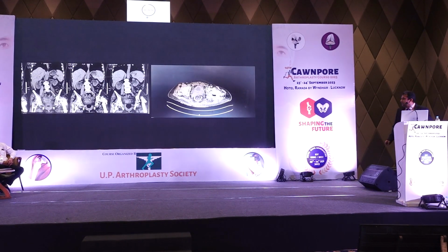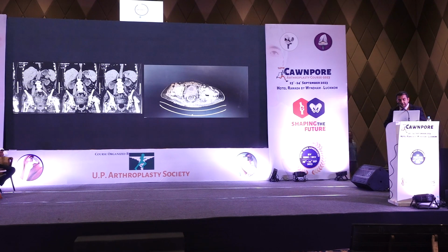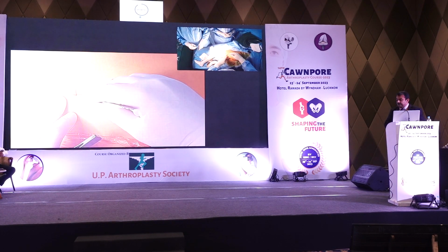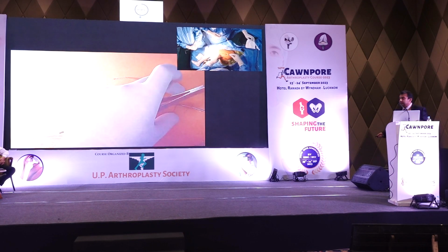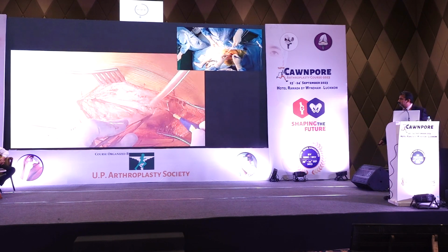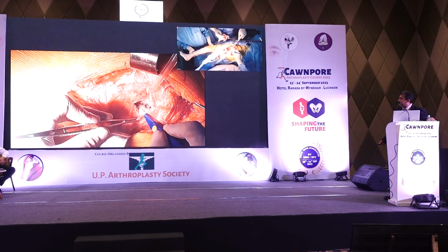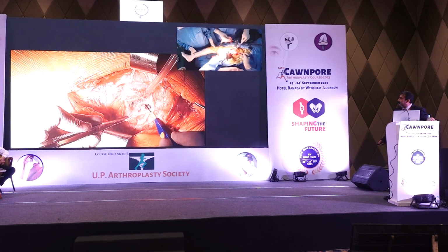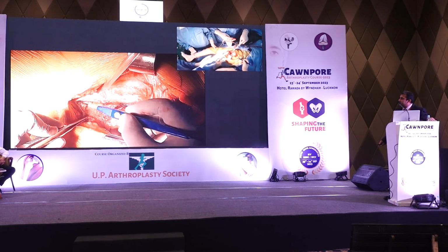These were the CT scans, and you can see there was a clear-cut non-union. The head is still there, but it's eaten up because of the screw cut-out, and obviously I had to intervene. This is basically a video presentation which I'll just describe. This is a bird's eye view, and this is a close-up view of the surgery. I usually use a posterior approach for all my hips primarily, as well as in revisions. And you see I'm just cutting and exposing the implant there, and since there was a lot of shortening, I preemptively released the gluteus maximus.